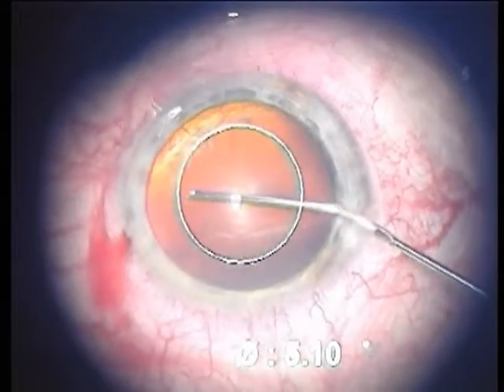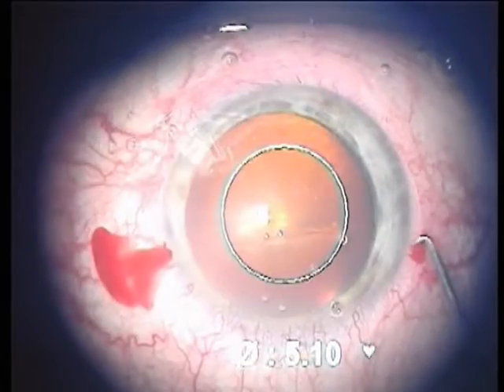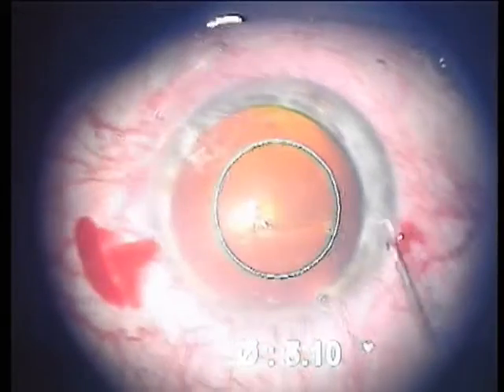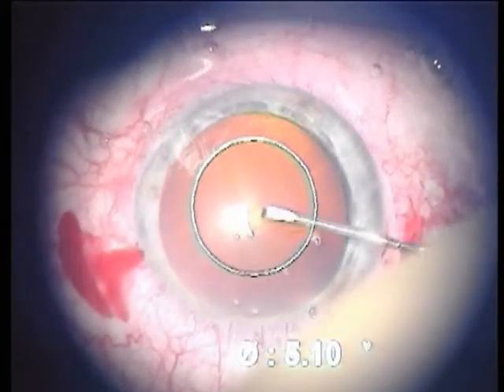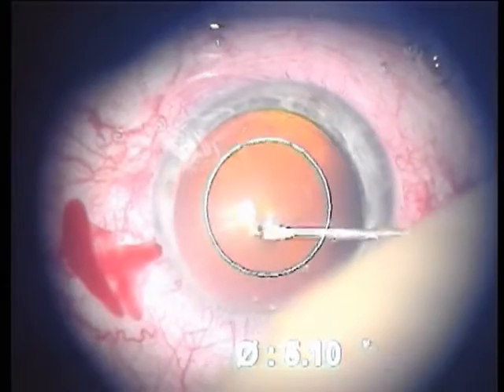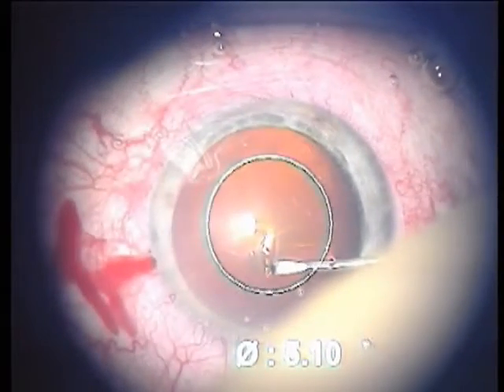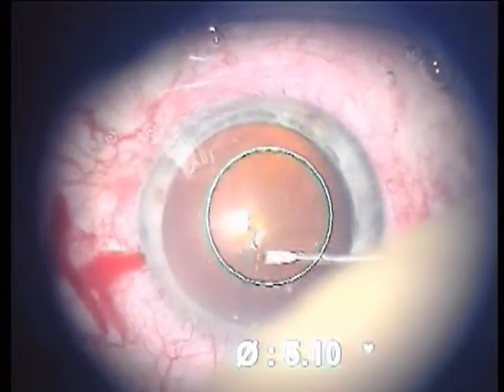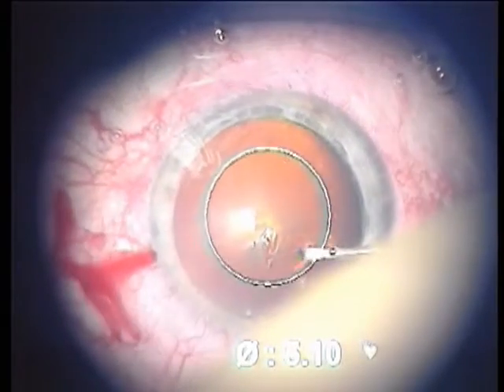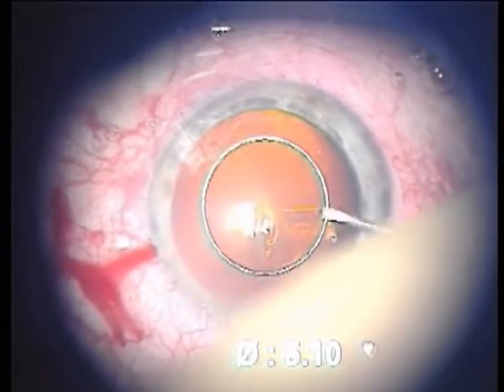The image around this determined point, the corneal limbus, is saved as a reference. The circle is displayed concentrically with this reference. All image data is processed by a powerful microcomputer and forwarded to the display control unit.